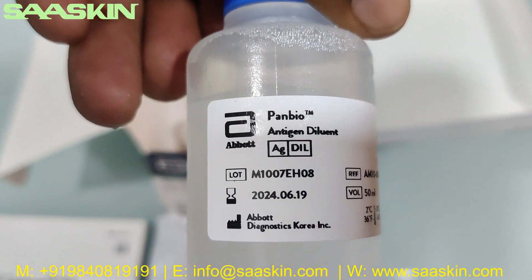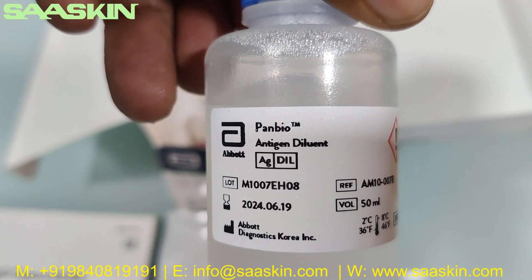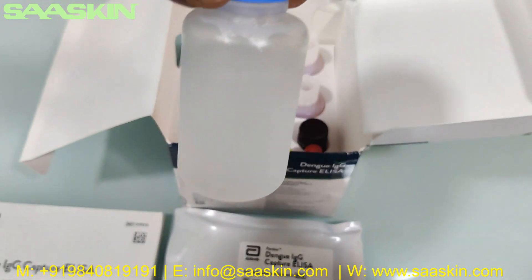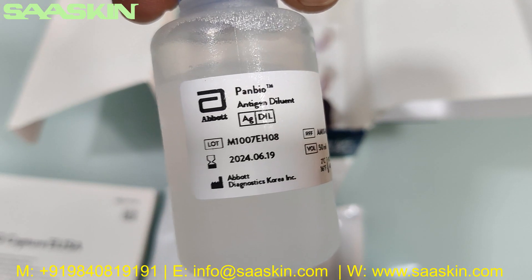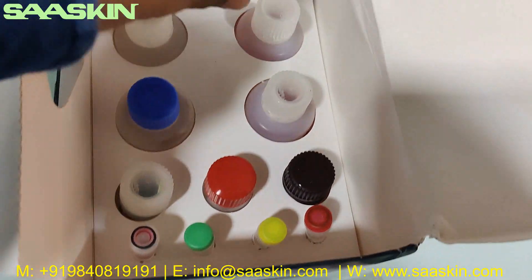Here you can see this is the antigen diluent, 50 ml. You can see what the bottle looks like. You can see the lot number and also the expiry period.